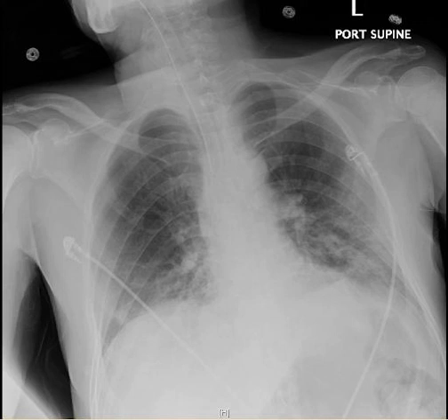The test which has greater sensitivity that's very easy to do at the bedside is ultrasound. Ultrasound has been used in COVID patients in China and in the United States to see if they may have pulmonary infiltrates.